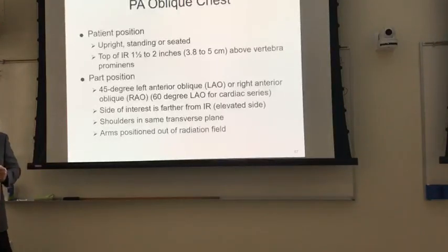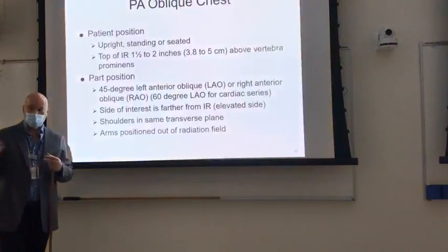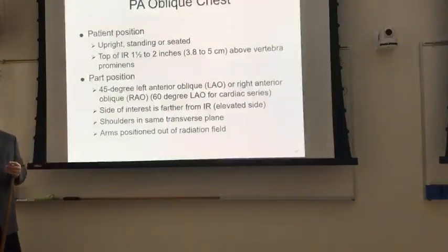Like, for example, if somebody had a suspected tumor maybe close to the hilum of the lungs, which is where everything comes and goes, right? So you've got the bronchi, you've got maybe the right atrium, you got a lot of stuff that might be projecting a shadow over that pathology.